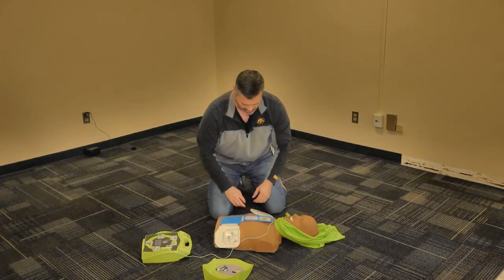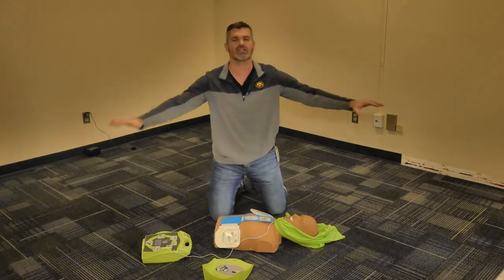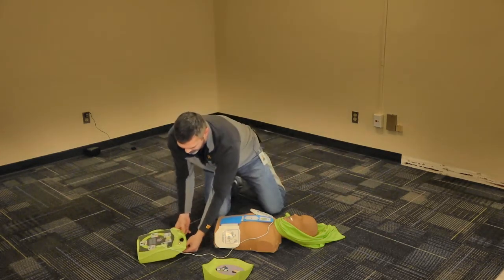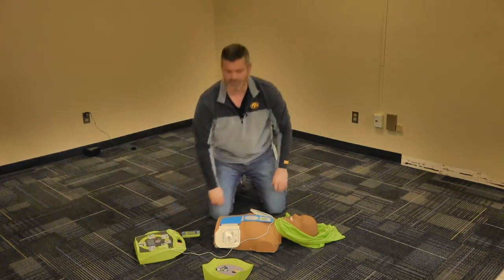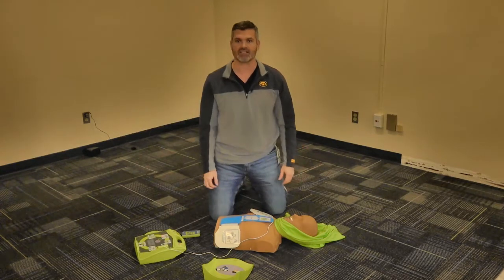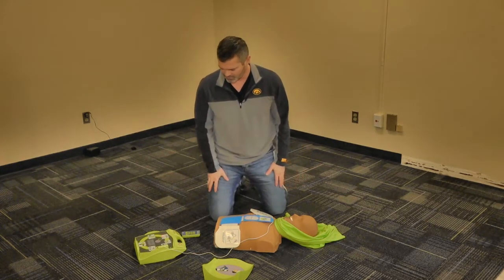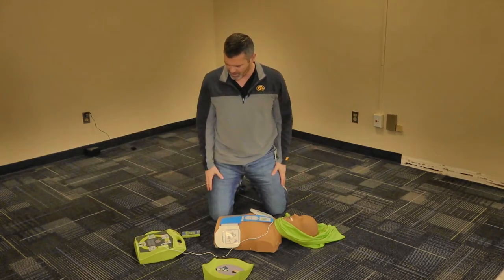When it says it's analyzing the heart rhythm, that's when you need to clear out the patient. We're going to clear everybody out. If you are touching the patient and it is analyzing the heart rhythm, it's going to pick up your heart rhythm and not deliver a shock. Clearing everybody out — we're going to wait.